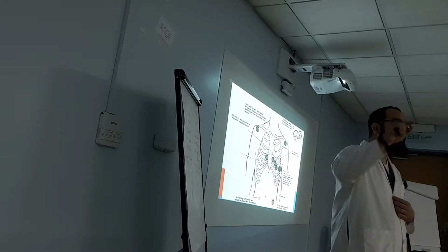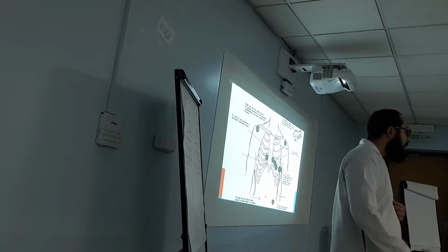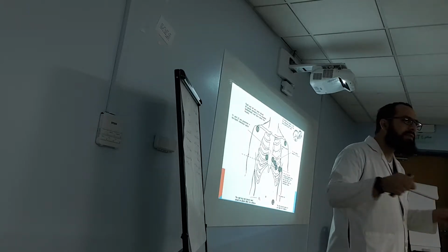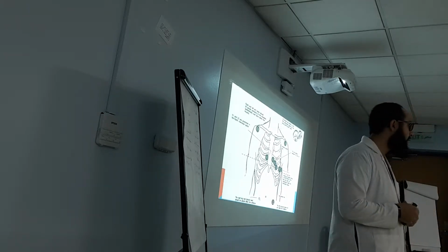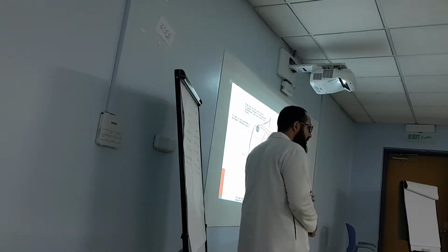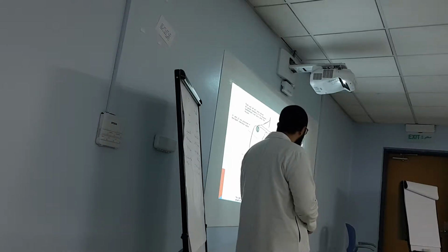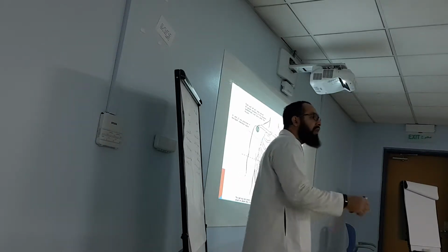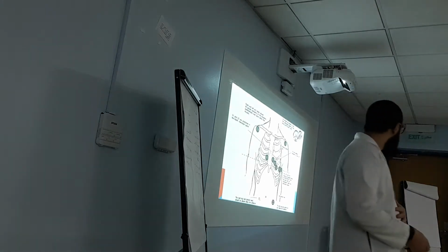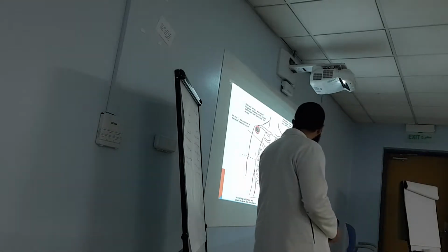So if you see ECG not clear, probably your right leg lead is not attached properly, or the lead is broken, or the wires are broken, etc. But if you are disconnected from left leg, you will not see ECG. Also, if you disconnect from lead 1, 2, 3, you will not see lead 1 or 2 or 3. Left leg also affects other leads. Again, this is the placement for those leads.